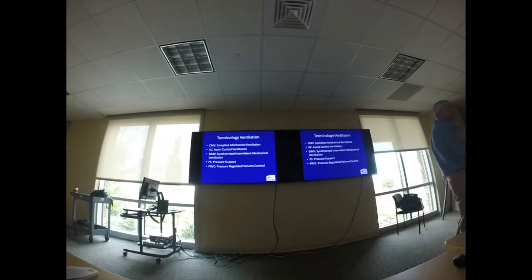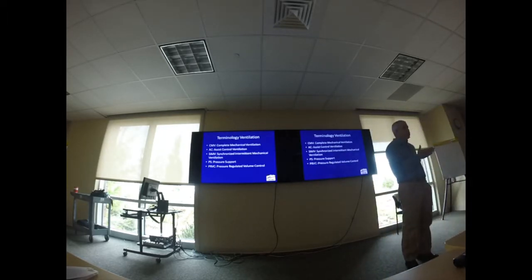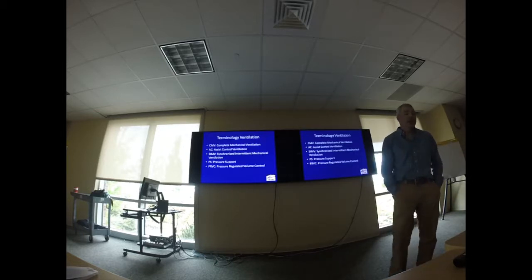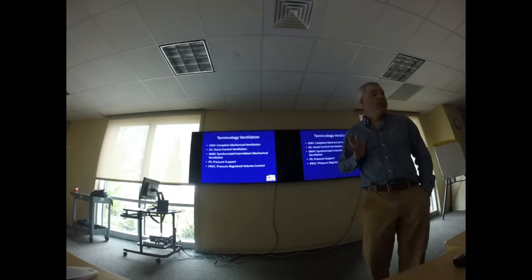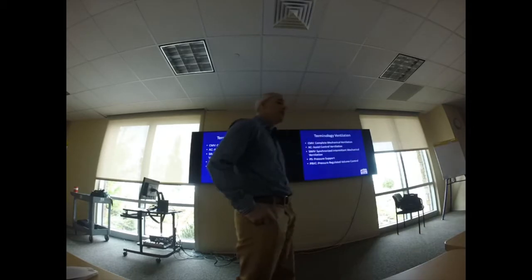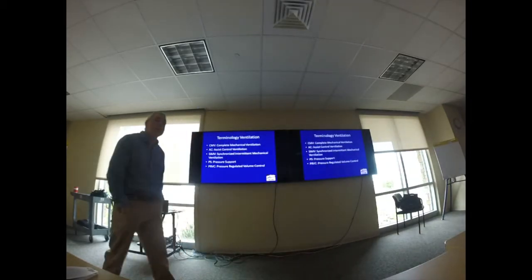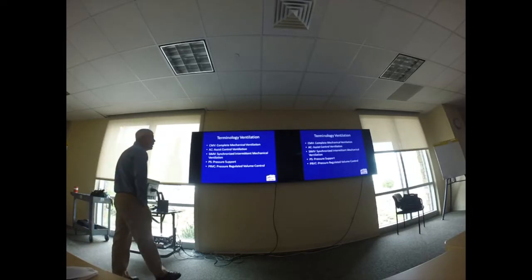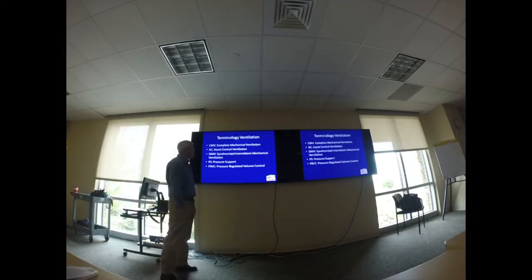So it's going to give 500 mLs for all 12 ventilations. On the 13th ventilation, it's going to give 500 mLs. On the 14th ventilation, it's going to give 500 mLs. So every breath that the patient takes, whether it be me driving it or them driving it, it is going to give what I have set for the patient. Does that make sense? So every breath that the patient takes, it has the parameter that I have set.